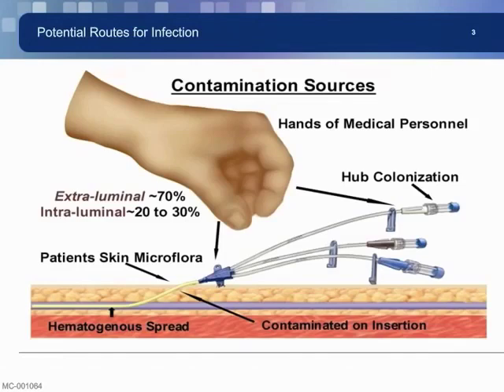Routes of infection. Understanding the routes of infection are key to reducing risk in daily practice regarding central venous catheters. Routes of infection include contamination of the catheter hubs, contaminated infusate, contaminated skin organisms, contamination of the device prior to insertion, and hematogenous spread or thrombus or fibrin sheath.